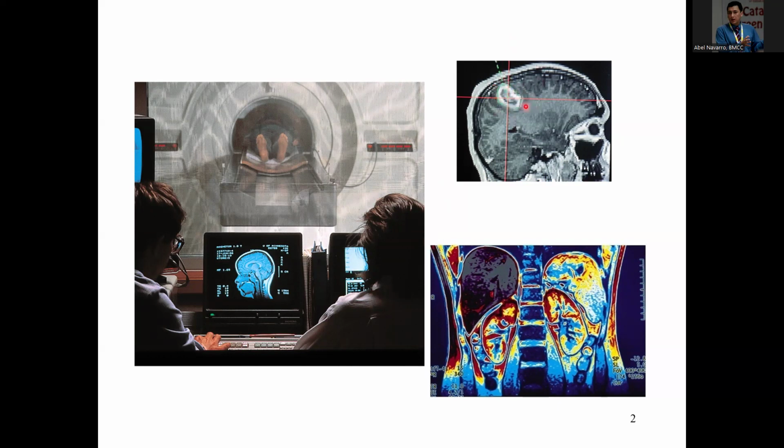For example, right here you can see that this person unfortunately has a tumor in the brain. So tumor, of course, it creates pressure inside of the brain. That pressure is alleviated by the brain by cushioning, right? You will put some cushion to that tumor, so that means water. So the body will protect itself from that strange tumor by putting water around it.